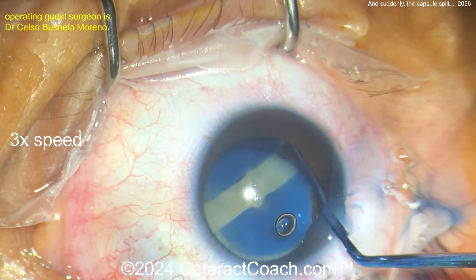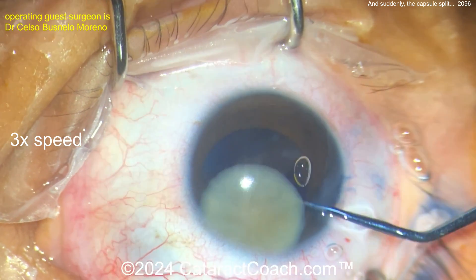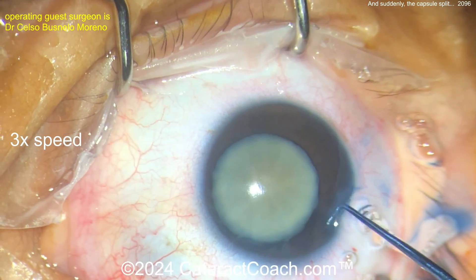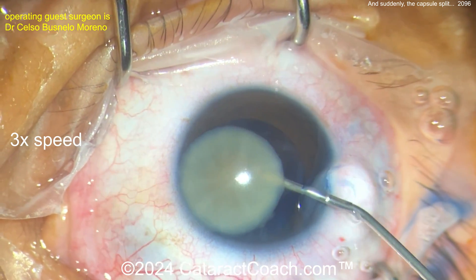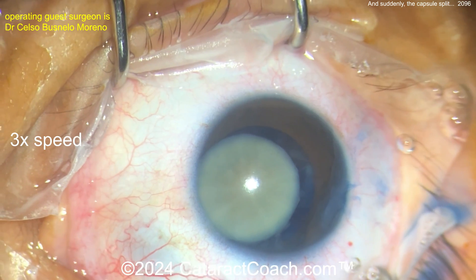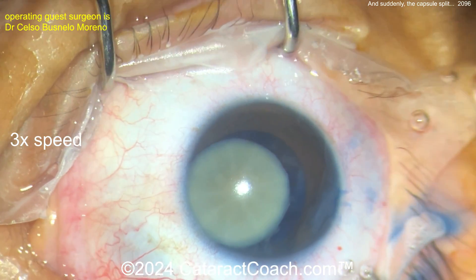There's probably a big wad of intumescent lens fluid — liquefied lens cortex — behind the nucleus. I like this idea: get that nucleus up. With that big Argentinian flag sign, you do not want to keep operating in the capsular bag. I agree. Viscoelastic behind it, dispersive agent probably a little bit in front of it too to protect the cornea.